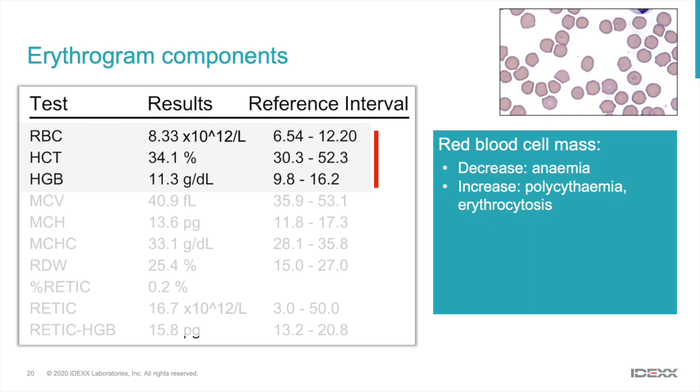I think most use hematocrit, and I like that because I have a manual method, the packed cell volume, that I can use to validate the results on the analyzer if I question those results.